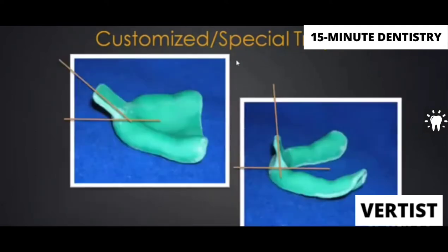Okay. Then there are the handle designs. Please ensure that for the maxillary it is around 45 degrees. For the mandibular it is nearly straight or slightly protruded. This depends on our teeth arrangement or the position of the teeth, maxillary and mandibular, so that we don't interfere with the border molding.